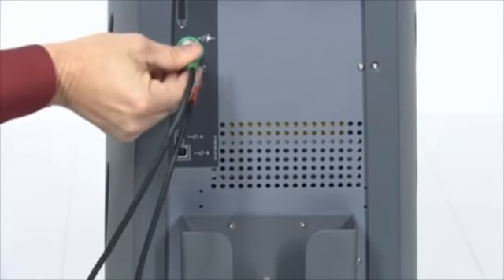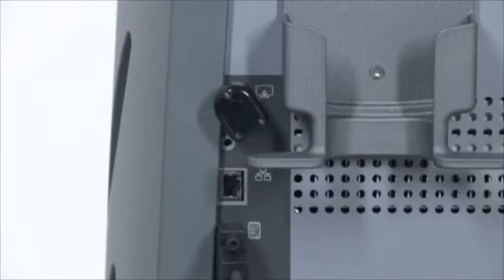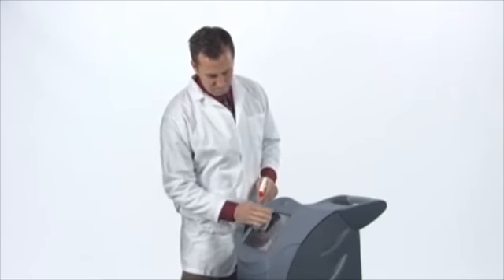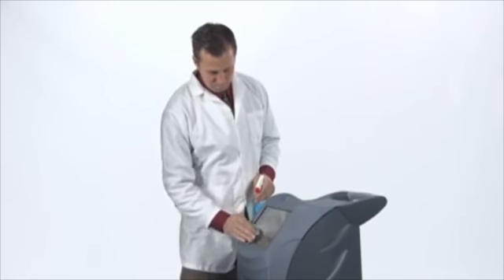Disconnect the automatic eye safety filters, if used, and remove the eye safety filter extension cable or emulation plug from the laser. Disconnect the external door interlock, if used. Finally, clean the exterior surfaces of the laser as instructed later in this presentation.